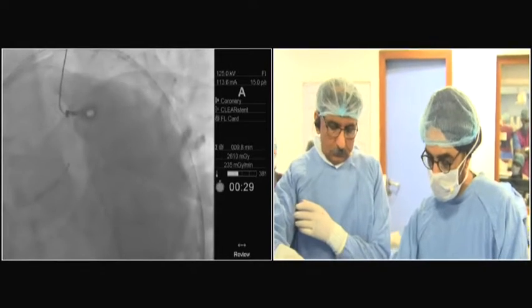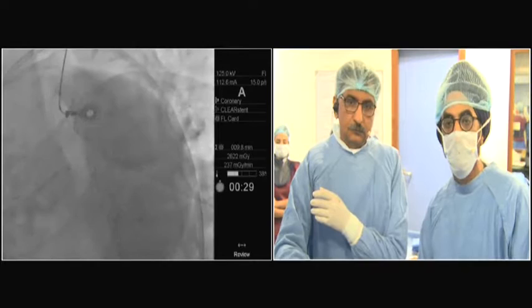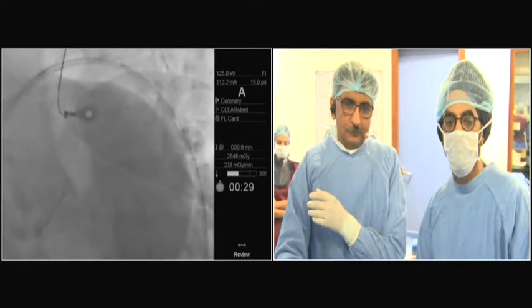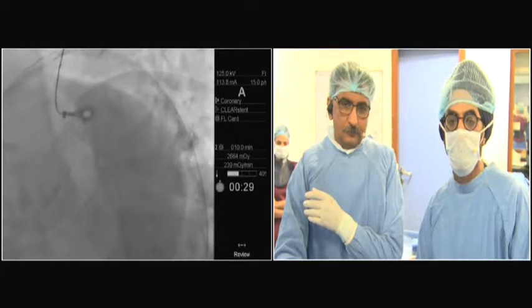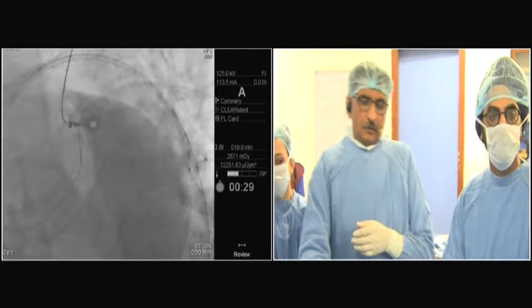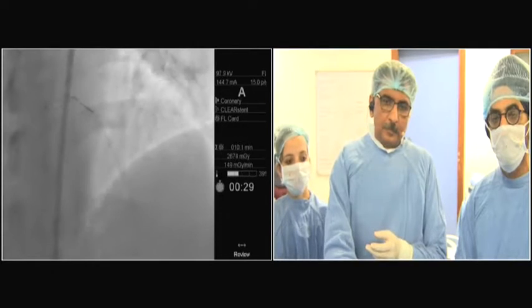As you said, the lesion in the diagonal is very, very long, and there is still a tight lesion distal to the diagonal stent. We don't know where to stop here, because if you increase the length of stent, then you increase the risk of stent thrombosis. So maybe the option of doing a provisional with a kiss and looking at what occurs on the side branch was a good option.